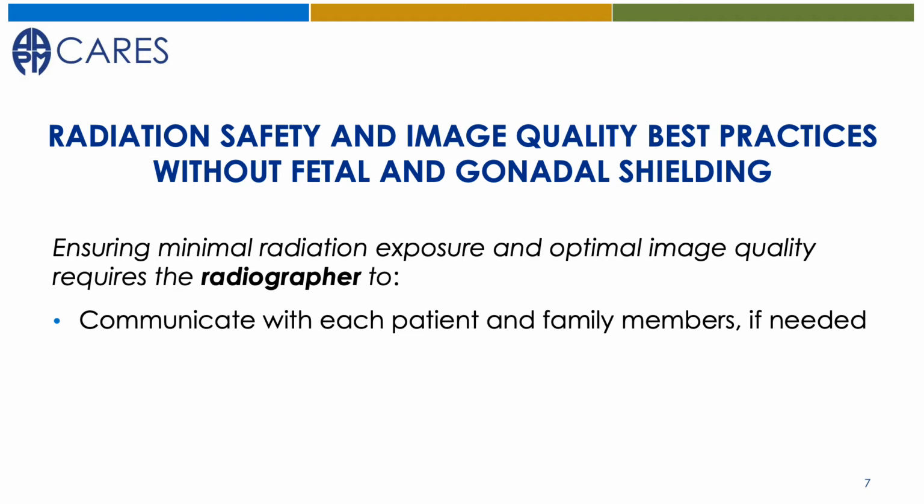Tell them you will need to touch them to properly position the anatomy. Inform the patient regarding current shielding practices, why the patient does not need a shield, while perhaps a parent, family member, physician, or radiographer may need to wear a lead apron. Carefully listen to the patient or family member's concerns and provide factual responses.